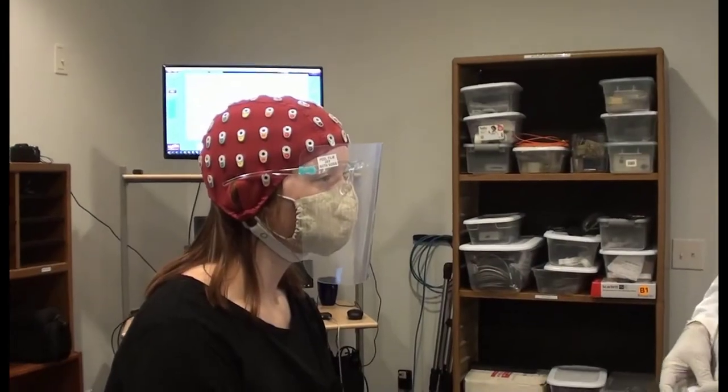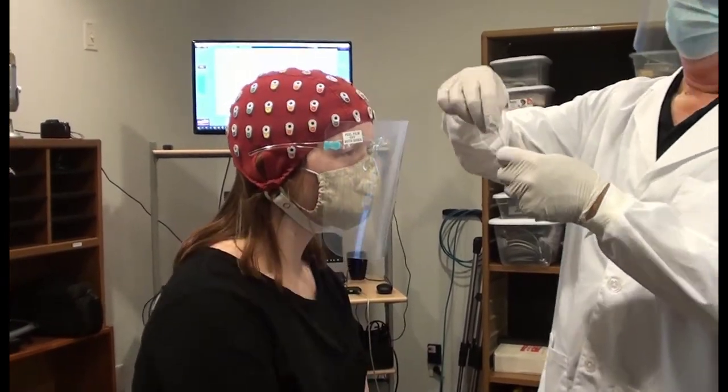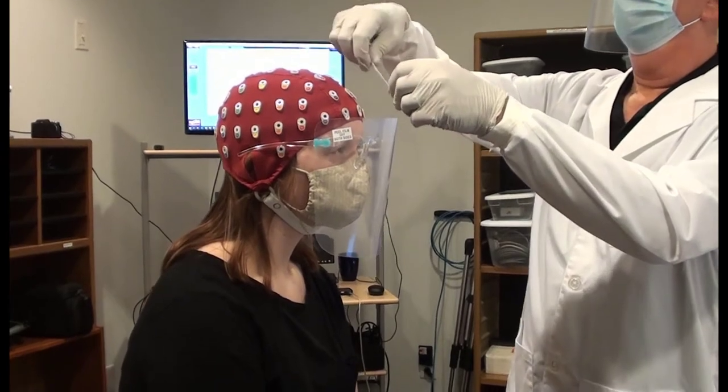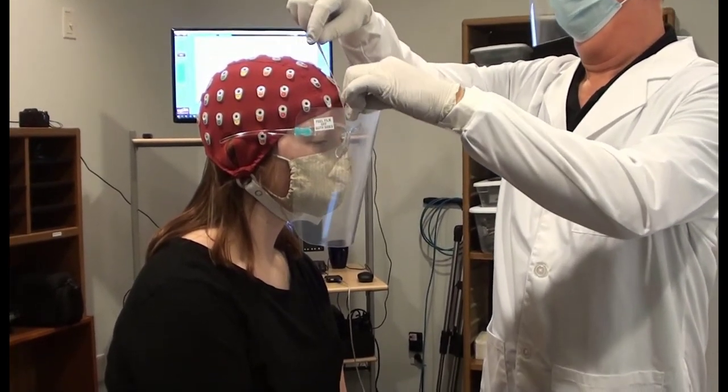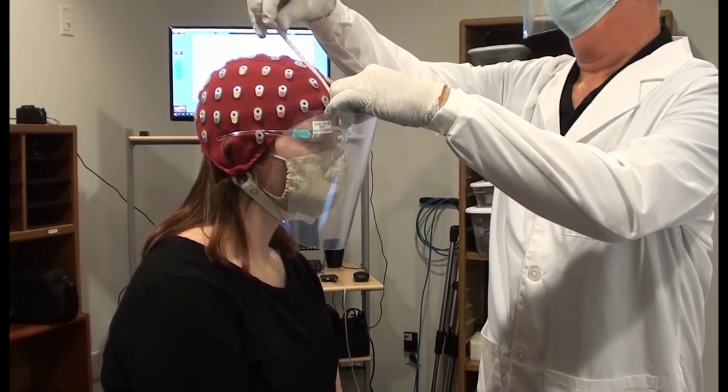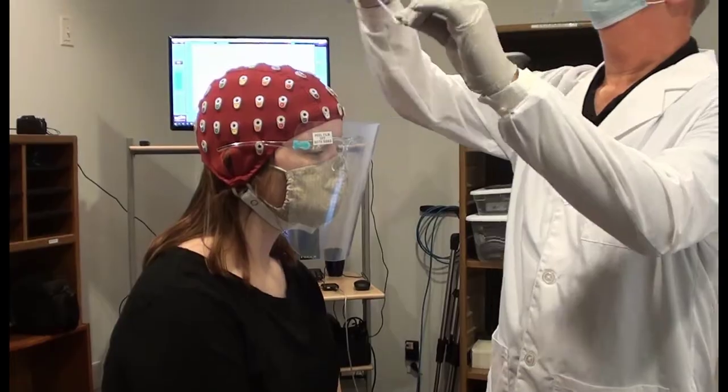Here's where that nasion to vertex value, half of the nasion to inion distance comes in handy. FYI, this is easier without the face shield. Measure the nasion to vertex distance and ensure that the electrode location, the small hole in the vertex or CZ holder, is at half the distance from nasion to inion.